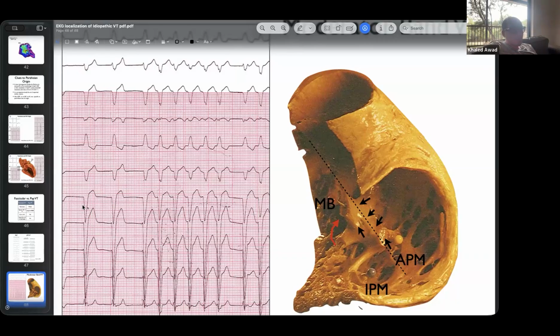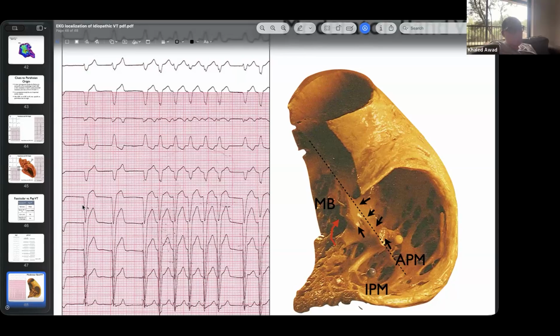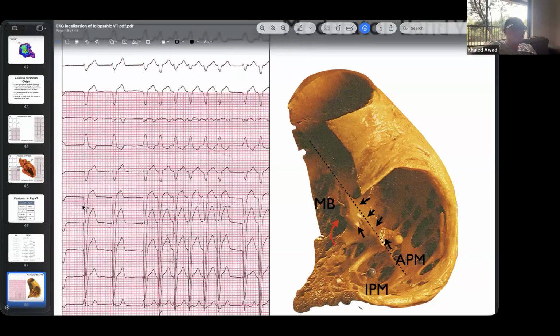Contact force can be a problem in the RV. That's why I said I like to have a sheath by the tricuspid valve, so I can have something to hold me in place a little bit and then use the catheter curve to get there. When I was very young, I had a lady that had a perforation on the free wall of the RVOT. It was just a steam pop. If you start going above 40 watts, you're more likely to have a steam pop.